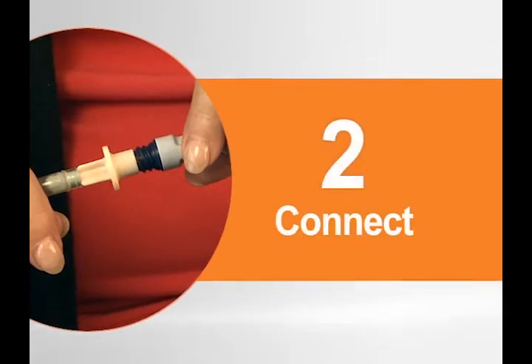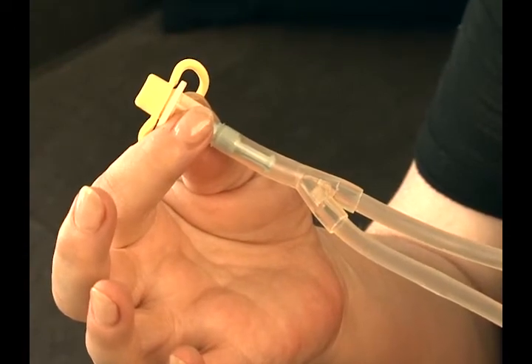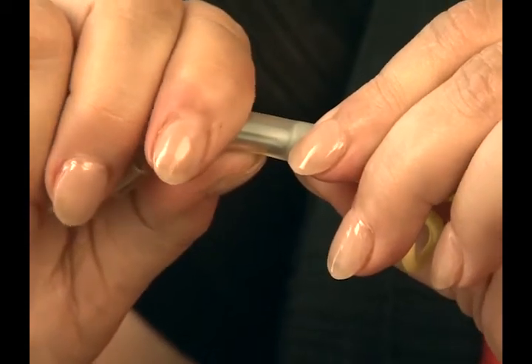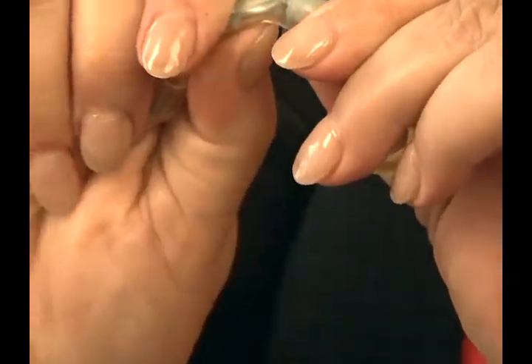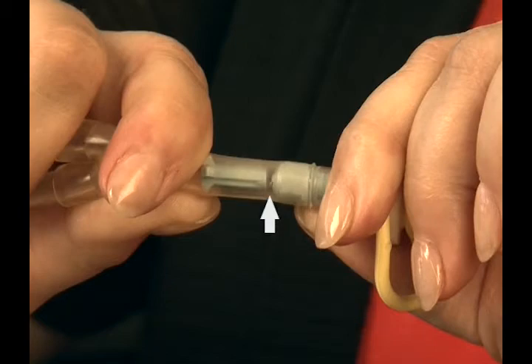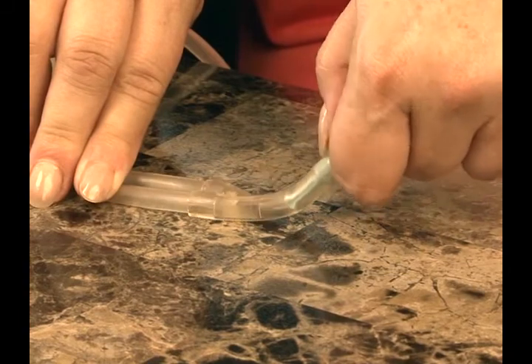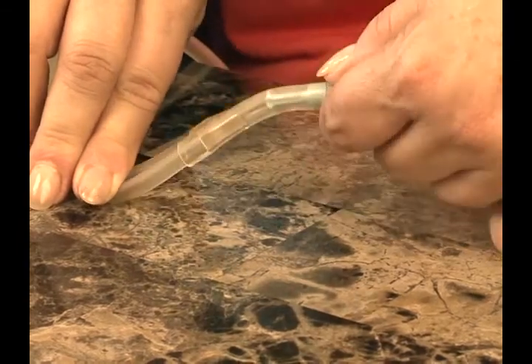Let's take a look at how to connect to the UltraBag system. First, break the blue frangible on the patient connector. To break the frangible, hold the base of the frangible in one hand and the tip of the frangible in the other. Next, bend the frangible outward until it breaks. Bend it back and forth two or three times to make sure it is completely separated. There should be a small space between the broken parts for good solution flow. The frangible can also be broken by holding the base between your thumb and forefinger while pressing the tip into a hard surface.